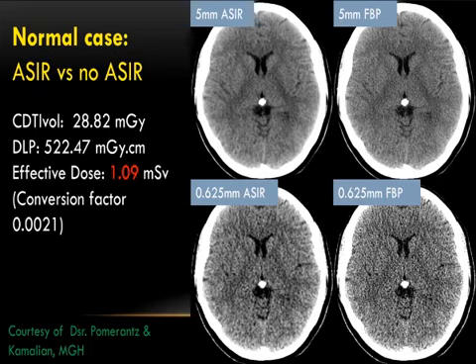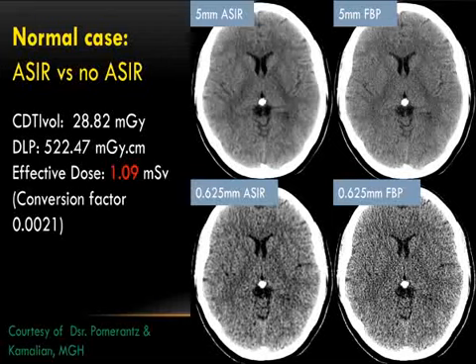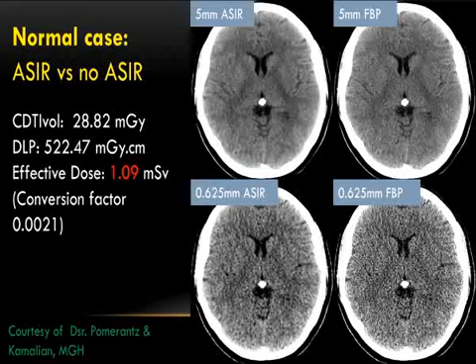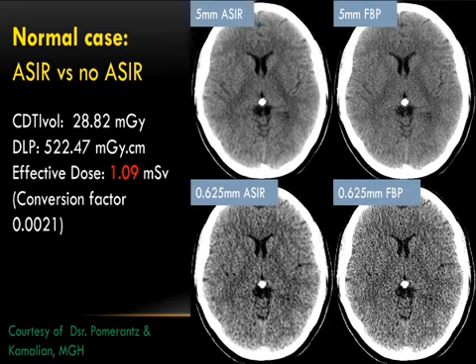But what is more surprising to us, to me at least, is the fact that this applies even for a very thin slice. So it's a 0.625 millimeter slice with filtered back projection, and this is the same slice reconstructed with ASIR. Okay, I can look at the gray-white differentiation. It's almost readable for stroke. Okay, and that's a revelation. So at our site, we have reduced the mA values, and at the same time, we have upped the percent ASIR that we are applying. On these thin slices, we are nowadays applying 90% ASIR.